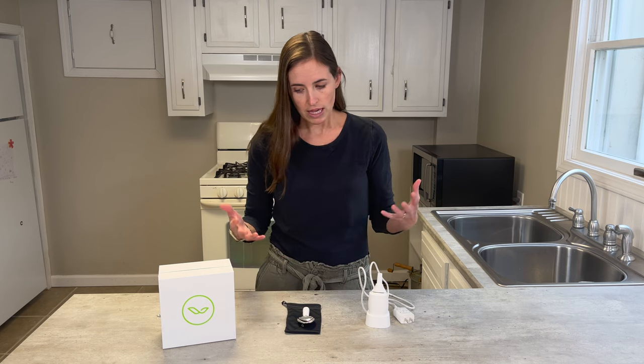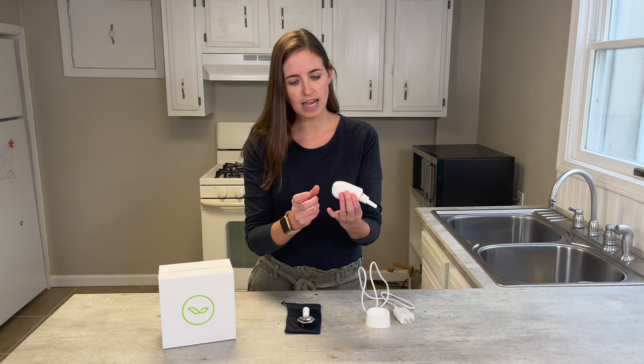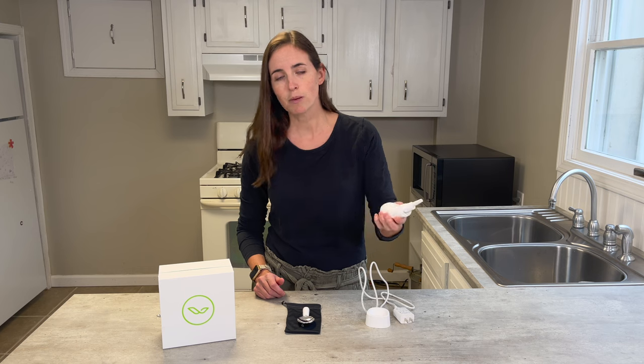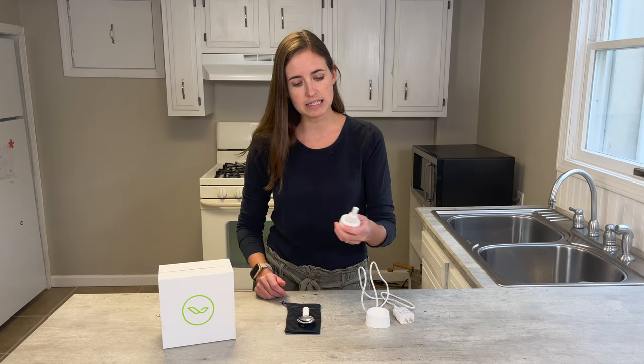This product has been on the market for a while. I've been able to test it with some different types of clients and I'm excited to share my thoughts. It comes with this motor base — this is where all the technology is housed. It has a charging base that you simply set it in, and it does need to be charged about every other day depending on how often you're using it. The charging system is fairly easy.